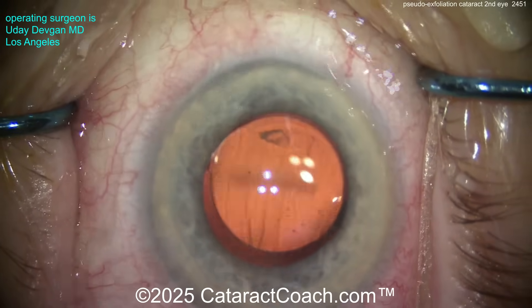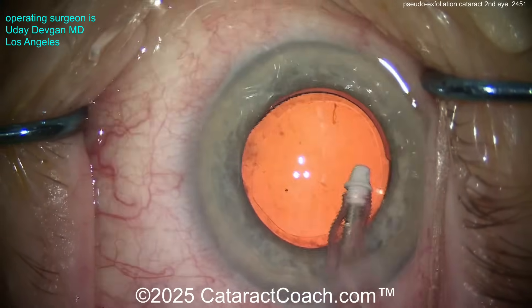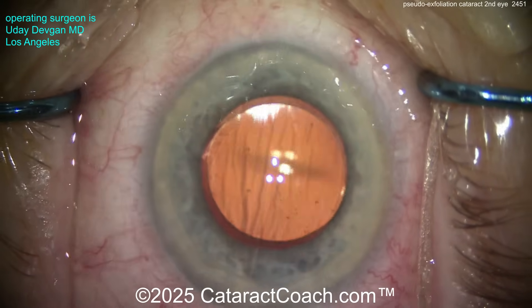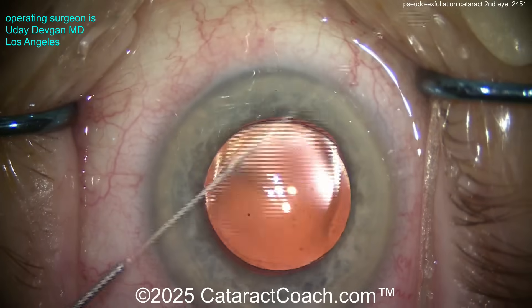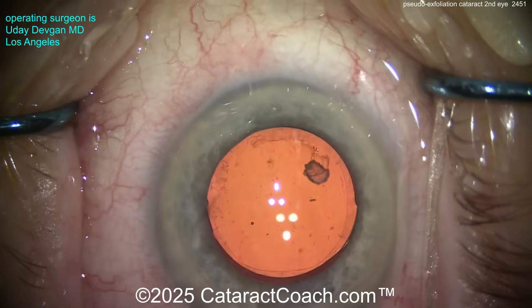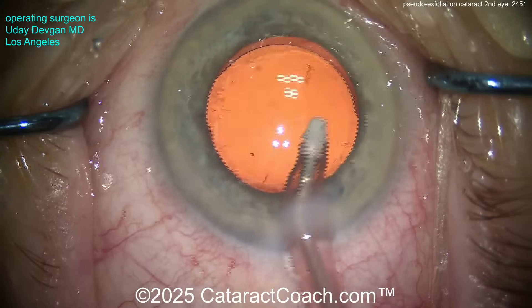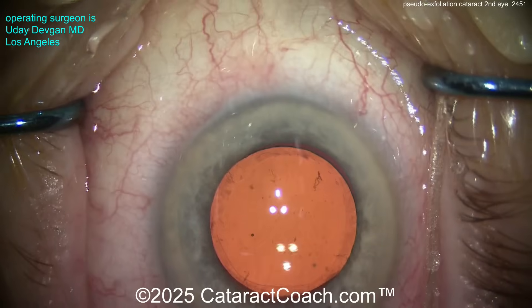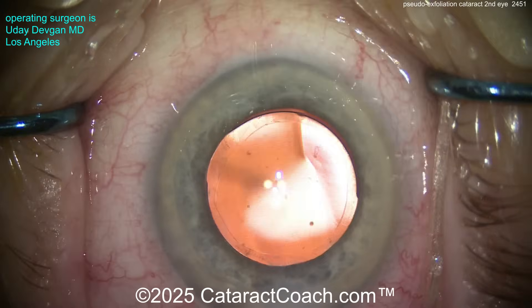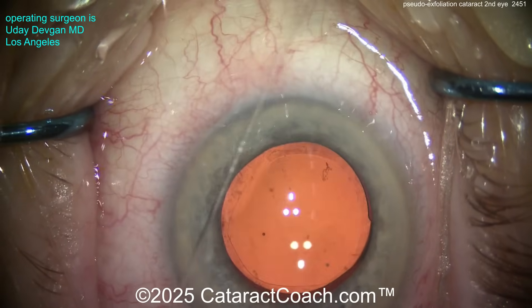Do you see that? There's a little nuclear chip there, a little epinuclear fragment — get that washed out of the eye. I told you this is an unedited video shown start to finish. It's not a horse race; that's why we're taking our time here. That looks all pretty clean now. Let's seal up the main incision. Do you see the little fragments there behind the optic, in the anterior hyaloid face — the little tiny fragments of lens material? Look at that, another big chunk! I'm glad we took our time here. Let's go back inside and remove that too. There's some degree of zonulopathy, because you have little tiny fragments of lens material that have gone through the zonular support fibers and are now in the anterior hyaloid face and Berger's space. Those are those little fragments there, and that's why I want to control the inflammation in the post-op period. This patient is going to have a very nice result, and again we'll watch them carefully.